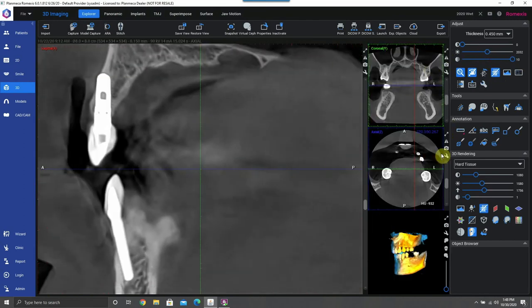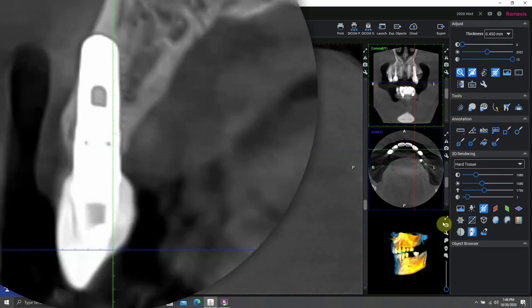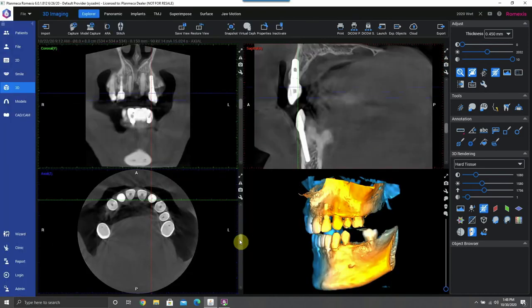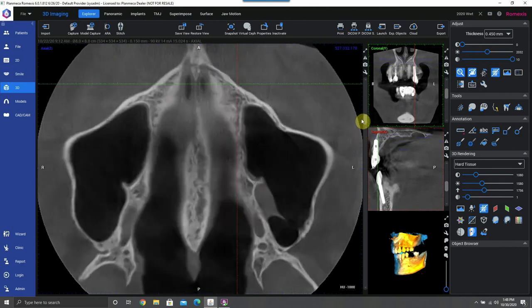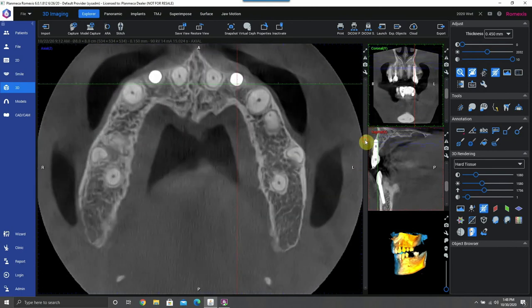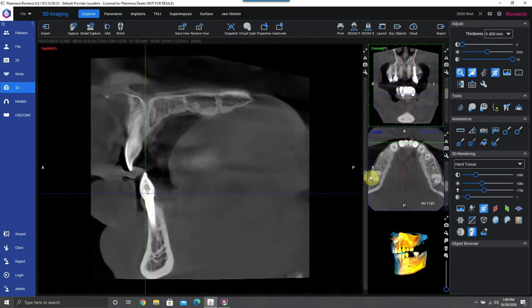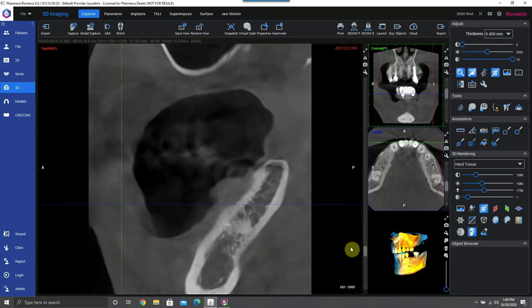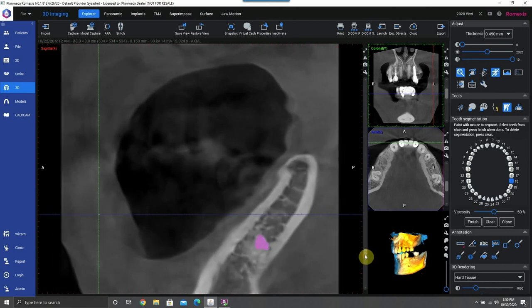Now I'm going to go through the CBCT with the patient, and I'm going to talk to them. Their existing implants, for example, have some fenestrations and perforations on the buccal plate. We have all sorts of issues, and we're going tooth by tooth with this patient. I'm talking to them about everything that I see, and I can assure you that in their last consultations, nobody did this with them. So this patient was just blown away. And look, we even see some idiopathic osteosclerosis there, and we're going to go ahead and highlight that.